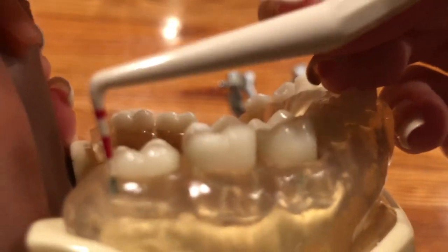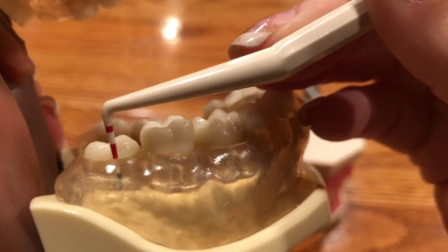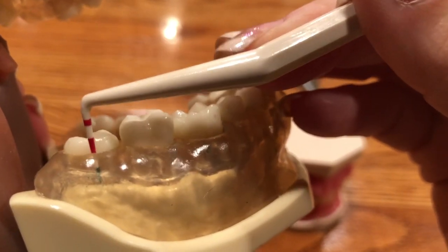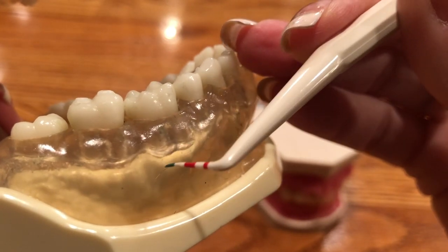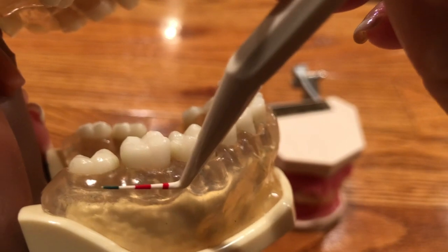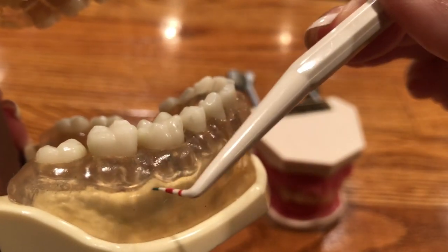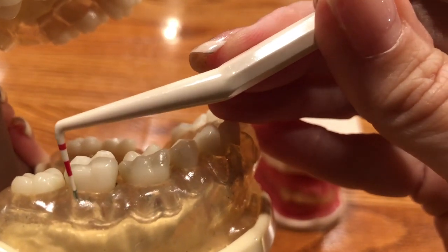Let me move it a little closer so it comes in. So 3, walking the probe around. This would be a 6. See how far down that goes? So usually when we're probing, it goes down to where the bone is. So you can see the bone through here and how it kind of scallops. In healthy teeth and gums, it kind of comes straight across and it's higher up here. So on this model, this is already showing bone loss, and I'll show you on the other model a little better once I show you the gum measurements.